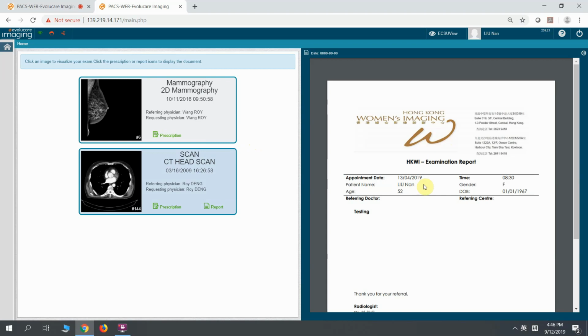patient. This is the simple introduction of ECS imaging. I hope you enjoy. Thank you.